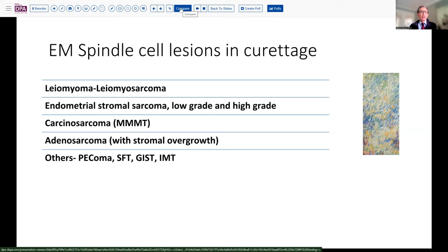Likewise, endometrial stromal sarcomas are relatively more common, but this does not look like a low-grade endometrial stromal sarcoma. So if it's an endometrial stromal sarcoma, it would be a high-grade stromal sarcoma, and within that category there are several possibilities. We know that high-grade epithelial tumors can lead to carcinosarcoma with mesenchymal transformation, which can sometimes obliterate any evidence of the epithelial component. Consideration of adenosarcoma is also possible, since some of those tumors can develop a very florid stromal overgrowth and can appear quite sarcomatoid.